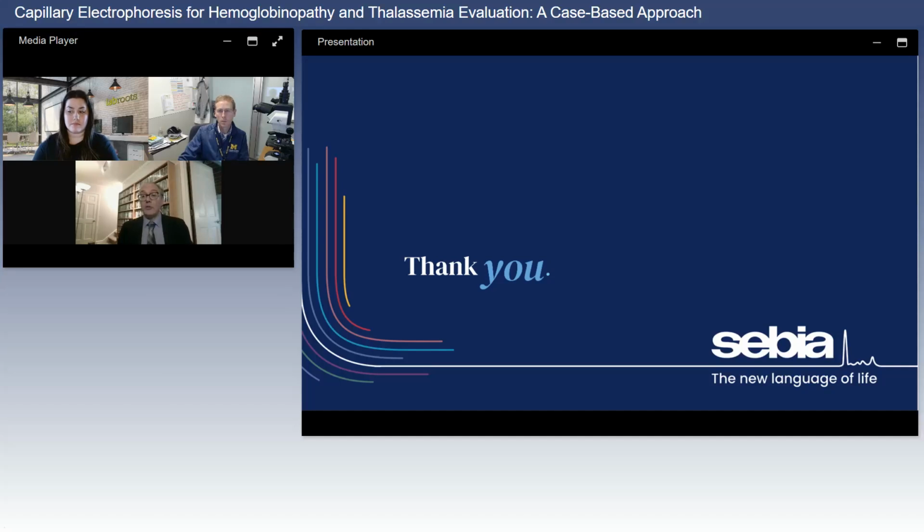As far as hemoglobin S separating from hemoglobin D, unfortunately, those two peaks, as we saw in the nice example that Mark showed us, migrate very close to one another. And as such, because they are overlapping, we can't really do a 100% accurate estimation of the two peaks in isolation. I believe they both migrate fairly close to one another in HPLC as well, which of course is another separation technique that's quantifiable.